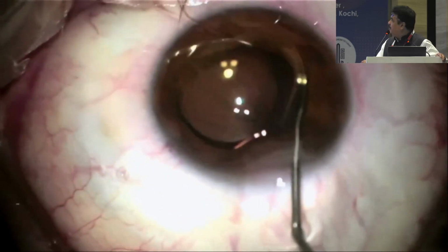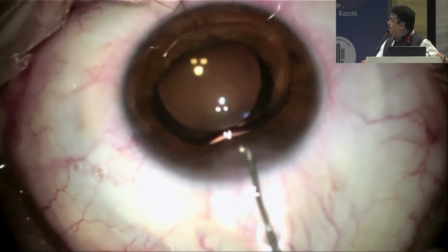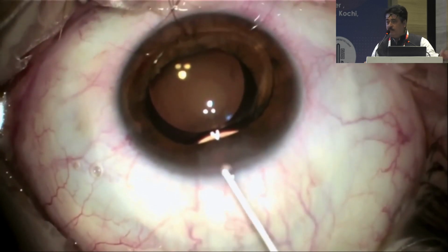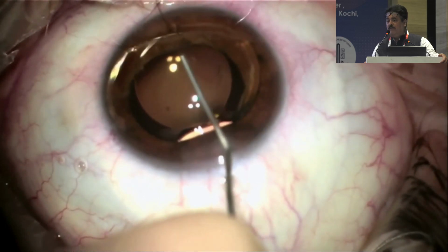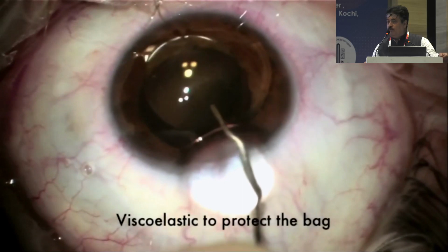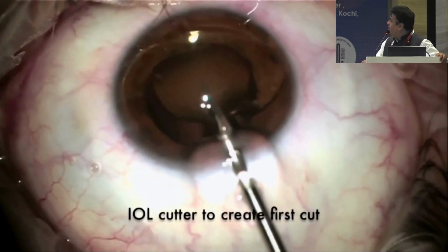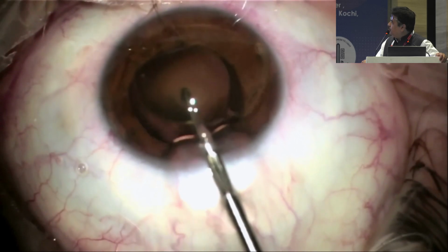Once the lens is in the anterior chamber, it is managed by a simple forceps, cutting forceps, scissor. This is easily available, 5,000-6,000 rupees at almost all the stalls nowadays. So we should have this scissor in our OT. It is really very helpful many times. Though you don't want to use it, it is your compulsion, you will have to remove it.